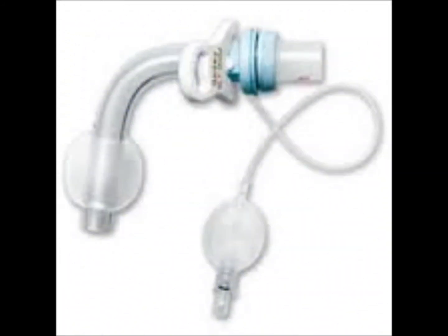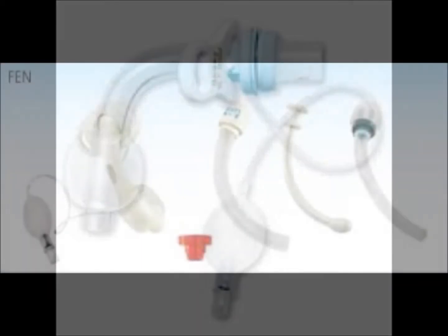This image is an extra long Shiley, which is similar to the regular Shiley, but just longer for patients with thicker necks. There is a disposable inner cannula. The main difference is how the inner cannula locks into place.